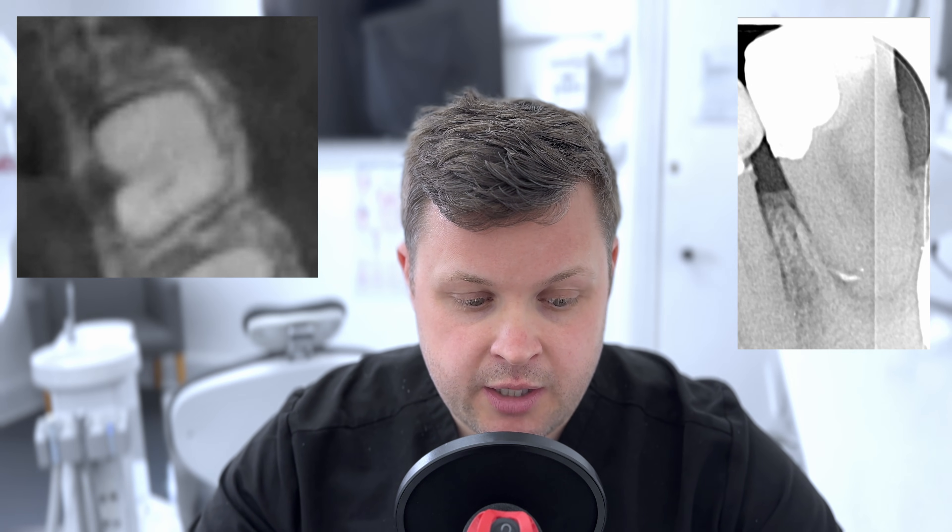Good morning! Brilliant case today — a c-shaped molar. If you're unaware of what a c-shaped molar looks like, essentially if you were to cut this tooth axially in the occlusal plane, you'd see that the root morphology is a c-shape. You can imagine that if you had a root morphology with no distinct canals but one long ribbon-shaped c anatomy, cleaning, shaping, and obturating that tooth is incredibly difficult.